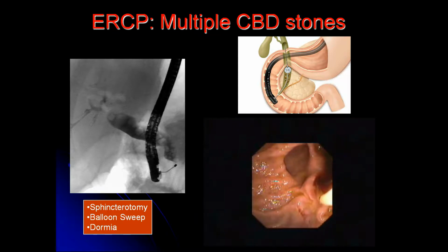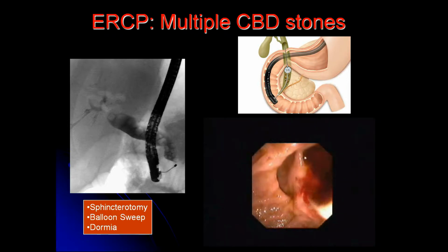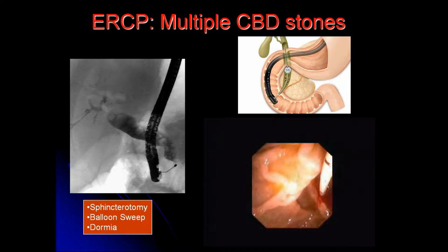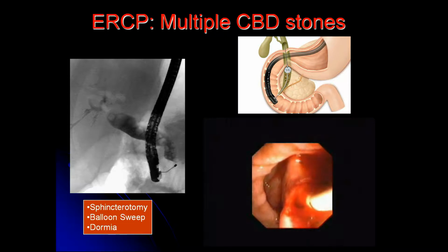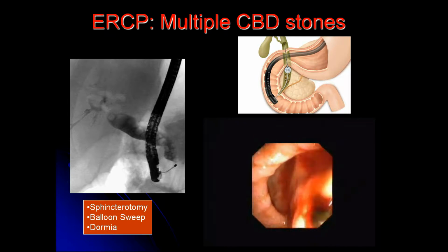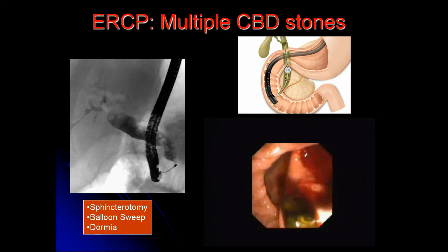Then through the enlarged ampullary opening, one could pass a Fogarty biliary balloon, and once the balloon enters the bile duct, it can be inflated and it can be seen under C-arm guidance where the balloon is. As we drag the inflated balloon, all the stones below the inflated balloon will come out one by one. This is the best atraumatic way to remove all the stones, and at the end of the procedure we can do another cholangiogram, called an occlusion cholangiogram, to ensure that we have removed all the stones.